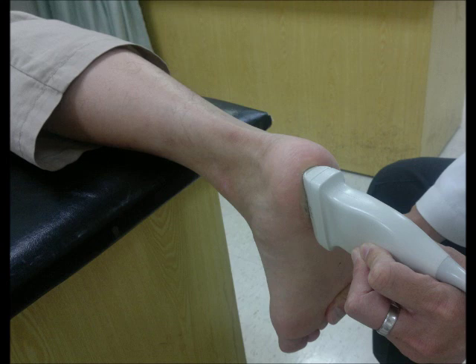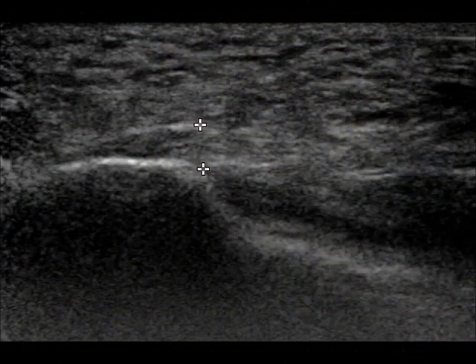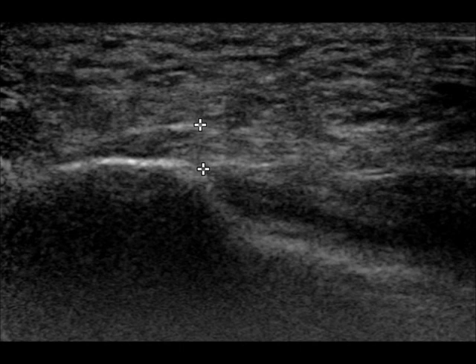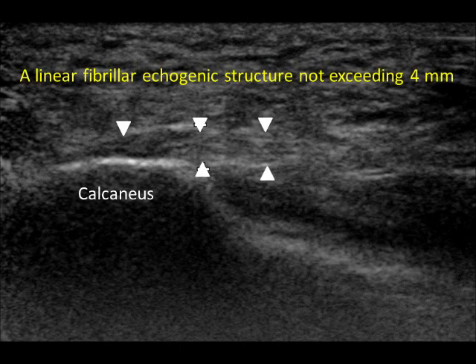In the long axis view, the plantar fascia can be identified by showing a linear fibrillar echogenic structure attached to the calcaneal cortex. The whole length of the fascia should be traced carefully. As the fascia is thickest at the proximal end, its thickness is measured at the proximal attachment to the calcaneus. Normally, the thickness of the fascia should not exceed 4 mm.